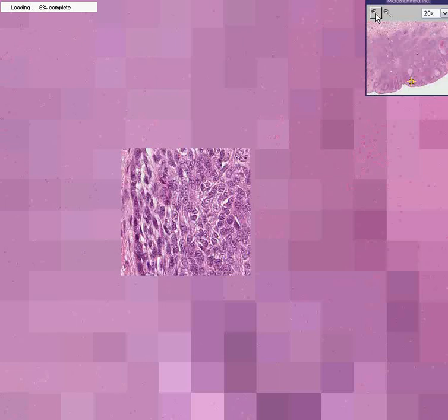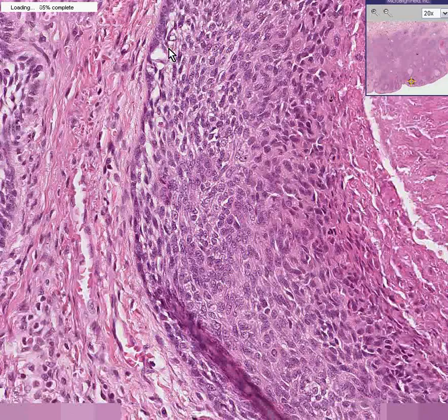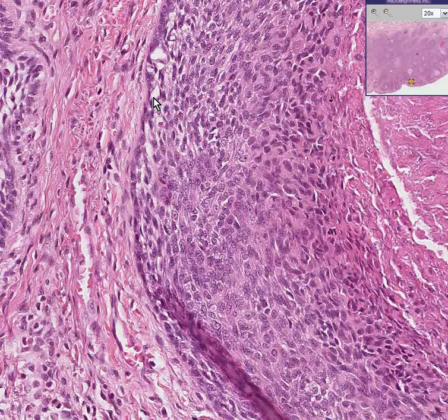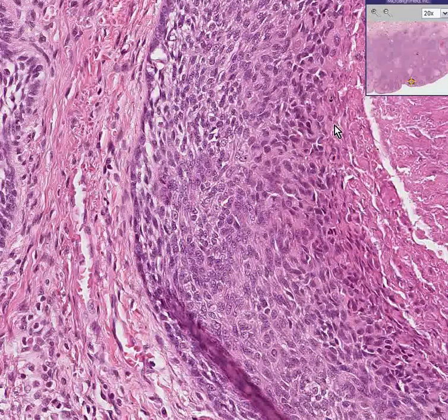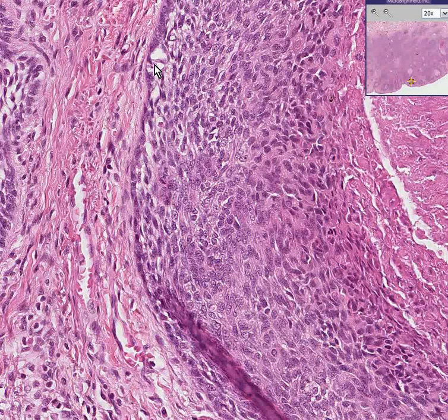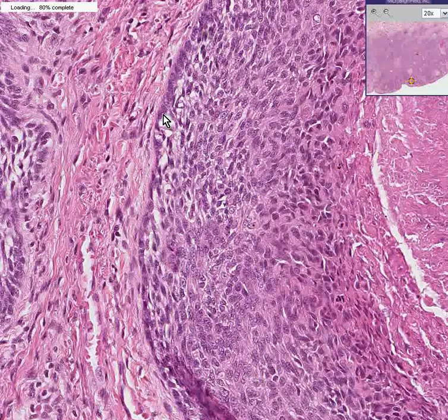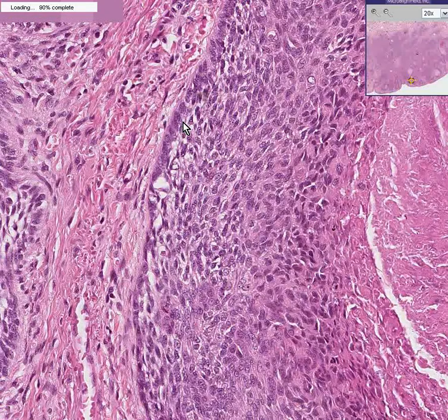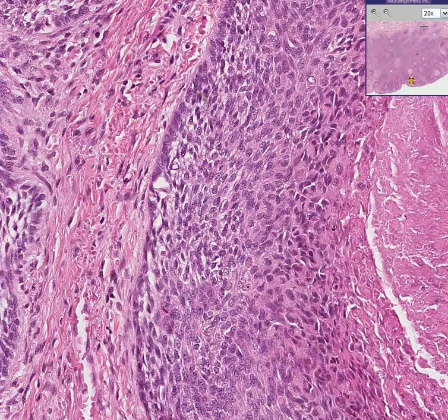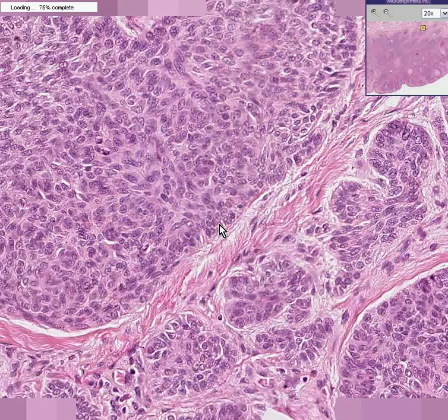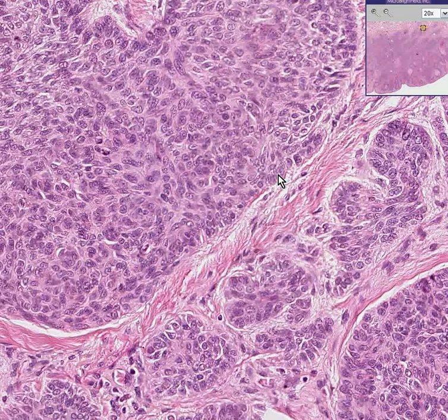They may not look very malignant from the start, and you may see areas in them that look more keratinizing. But the classic appearance — you won't see this in squamous, you won't see it in melanomas — is the palisading. We can go to just about any nest here, whether superficial or deep, and you can see the palisading.